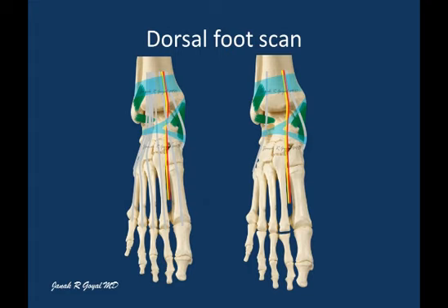The anterior aspect of the foot can be examined with the patient supine, foot free for easy manipulation, or patient seated, knee flexed to 45 degrees with the foot resting on the examination table. Examination of the foot is based on clinical presentation and should be done in both long axis and short axis planes. For the purpose of learning, examine all different joint cavities between the tarsal and metatarsal bones.